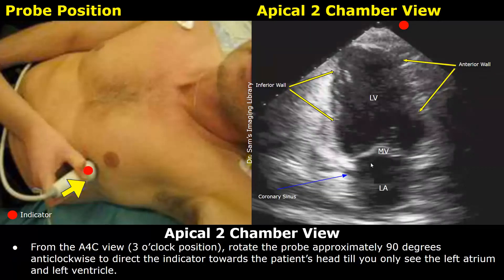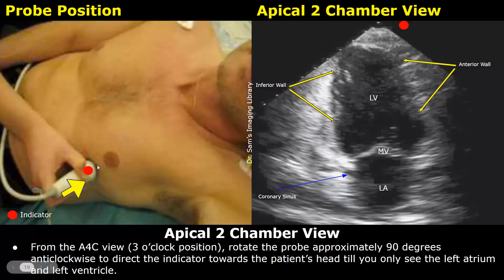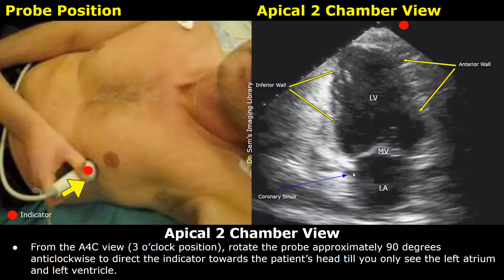Then we move on to the apical two-chamber view, which focuses on the left heart chambers. From the four-chamber view at the three o'clock position, rotate the probe approximately 90 degrees anti-clockwise to direct the indicator towards the patient's head until we see only the left atrium and left ventricle. This small vessel near the left atrium is the coronary sinus.